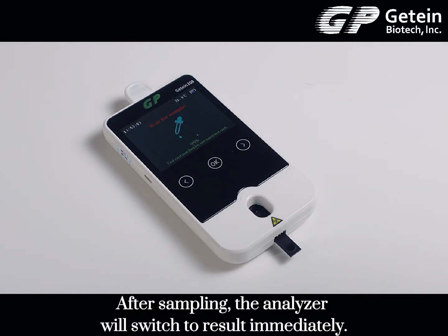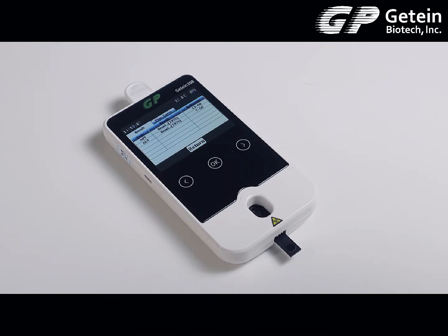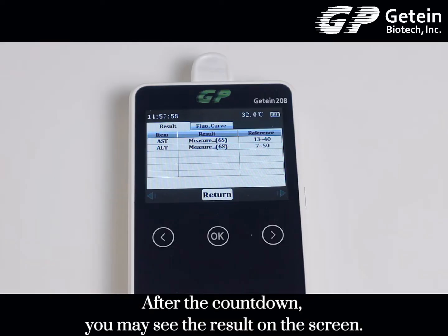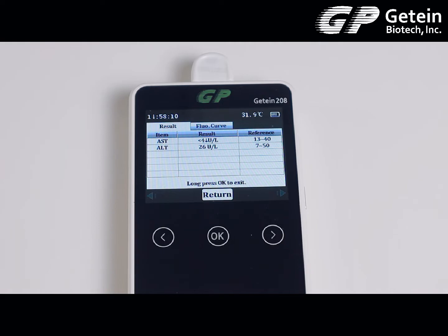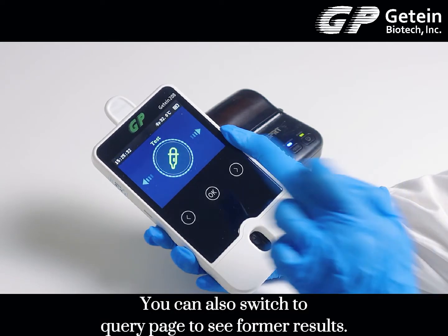After sampling, the analyzer will switch to results immediately. After the countdown, you may see the result on the screen. You can also switch to the query page to see former results.